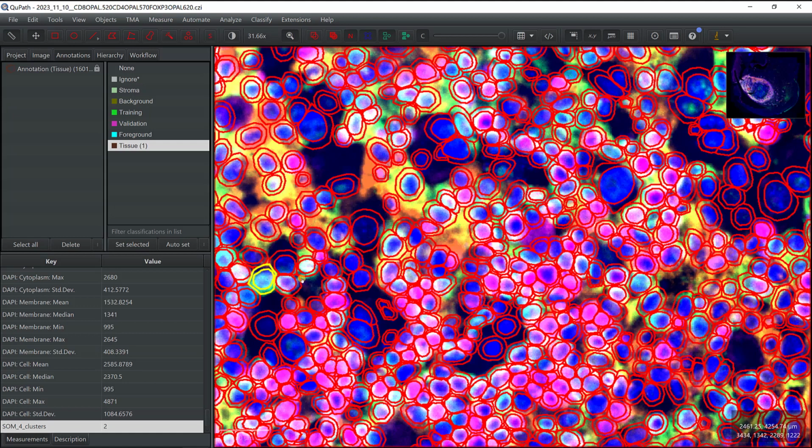So just a little warning here. When you do unsupervised clustering, you just look at the average intensity, and if you have very clean markers, that will give you nice results. But if you have markers that are not that clean, you might make mistakes, and so an object classification with QuPath might be more accurate. You can also find strategies where you mix them: for all the nice markers, you can do unsupervised clustering, and for those that are a little trickier, you do object classification.